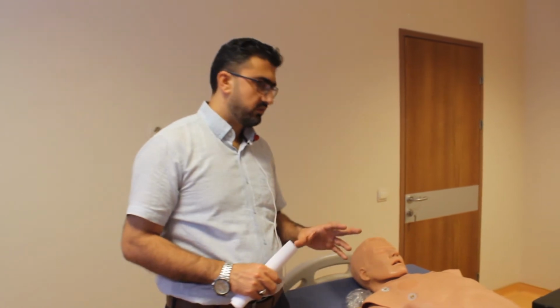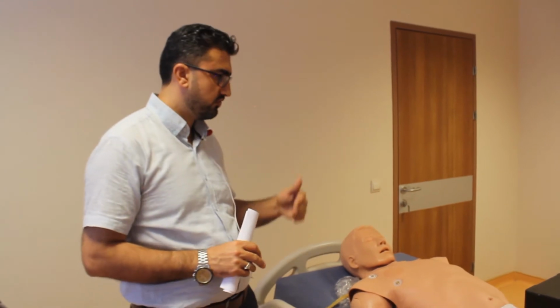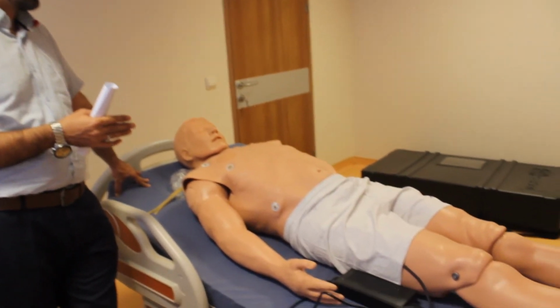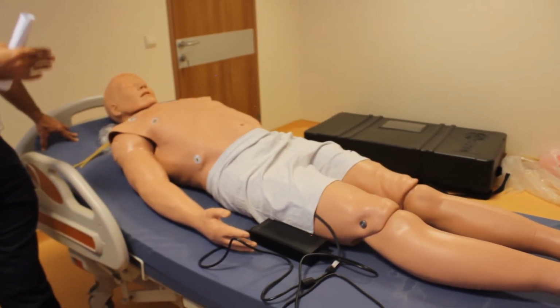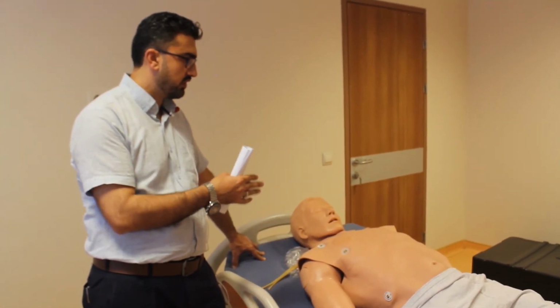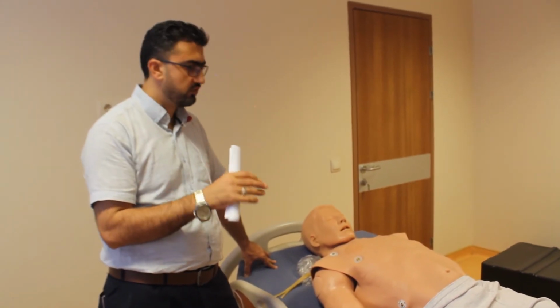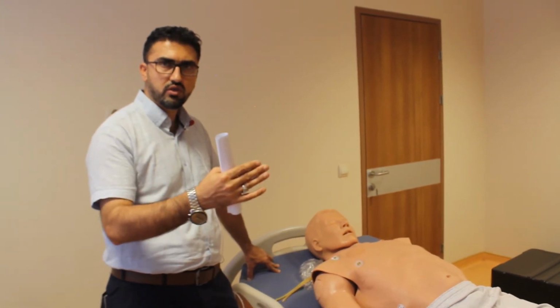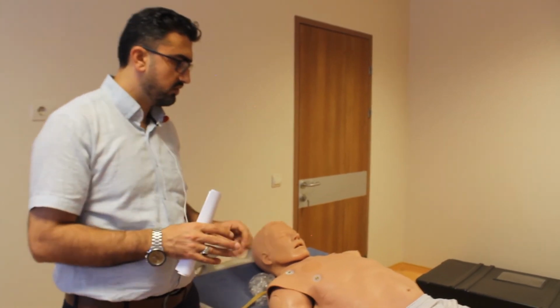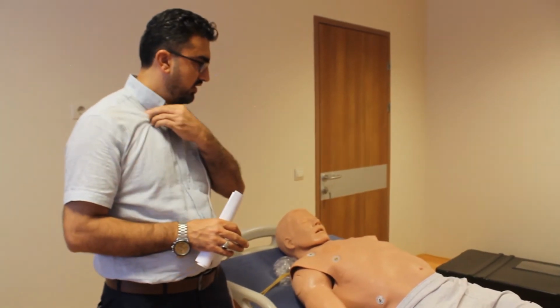Another simulation dummy is used for the surgical and medical purposes of teaching medical students. For example, examining the patient, such as examination of the leg, the abdomen, the chest, the head, the pulse rate, the heart sound, the lung sounds. It is computerized, and you can change the sound. For example, the heart sound, you can change to a pathological one. You can set it as a normal heart sound, and the same for the other systems, for example the chest, the abdomen, anywhere.